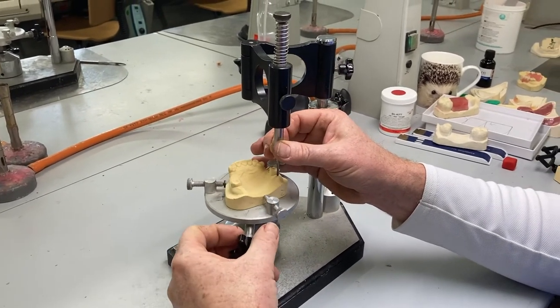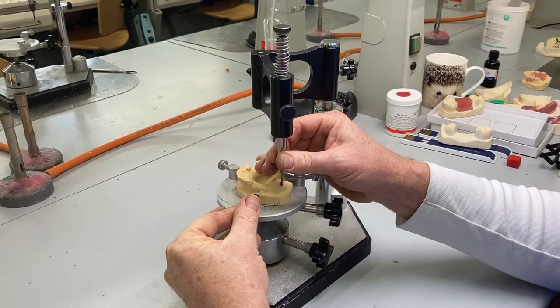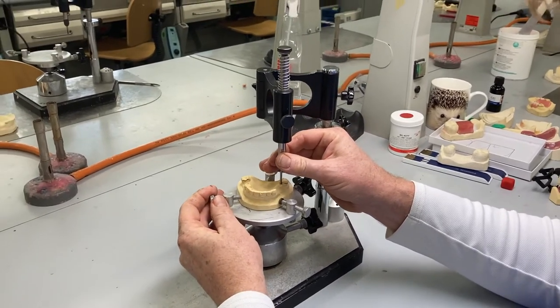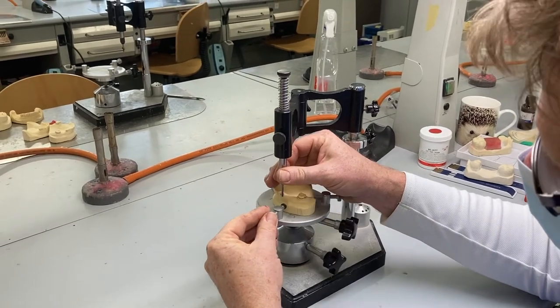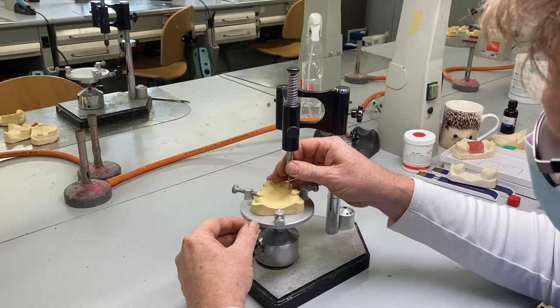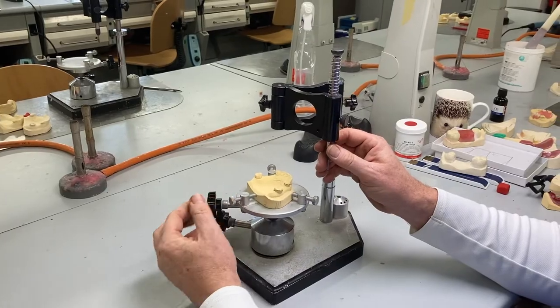That line appears on the most bulbous part of the tooth. By keeping the pencil lead down to the gingival level, we're making sure we're finding the bit that sticks out most — the equator of the tooth, the most bulbous part. This is termed the survey line. Everything below this line is undercut relative to this path of displacement; everything above the line is not. Everything below the line can be utilised for gaining retention by putting a springy clasp in there or by putting the body of the denture into that area.